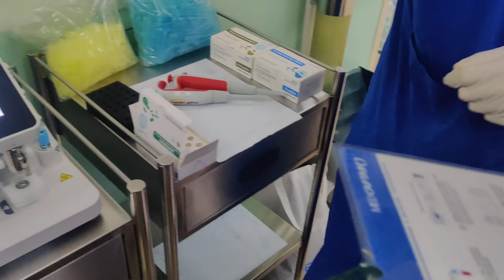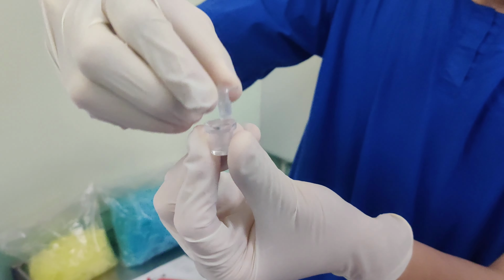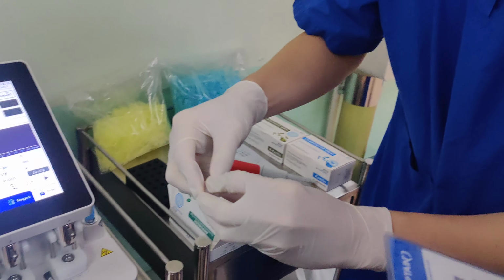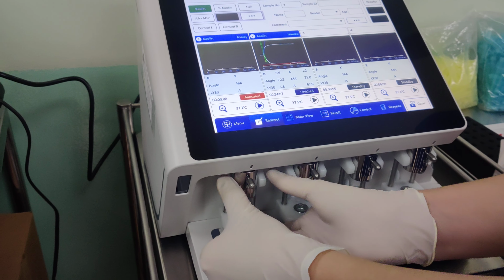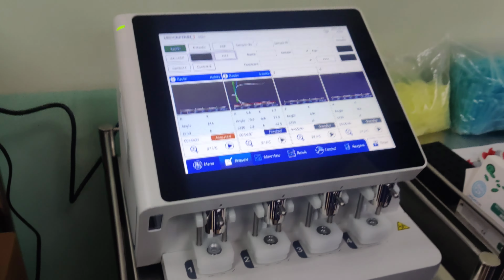Place a common reaction cup. So this is the reaction cup. Everyone see? This cup, it has a lid. So you can see this is the mold for the needle to go in. So how we load it? We just place it in the mold. Just put it. Okay. How to load it? I show everyone. You just push up. Then you can see, now the cup is exposed, the lid is loaded on top.